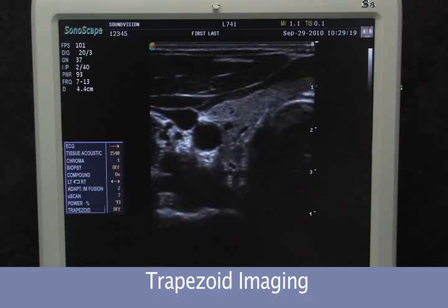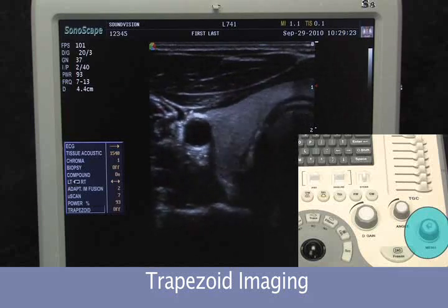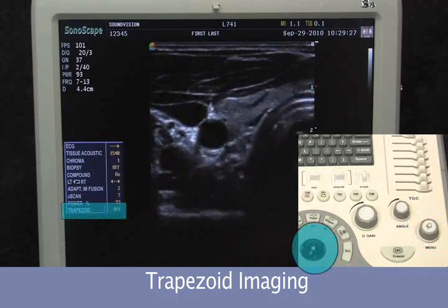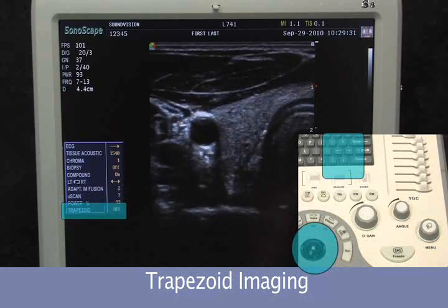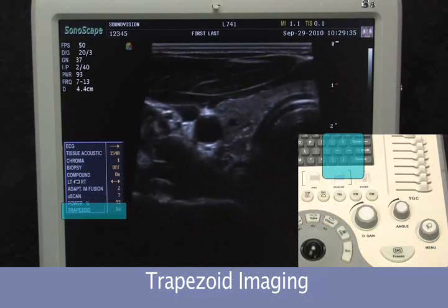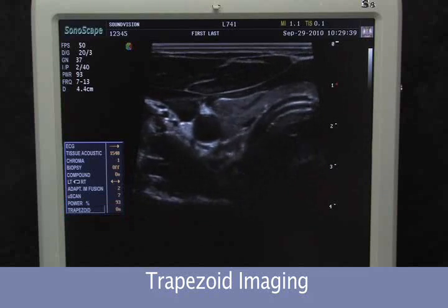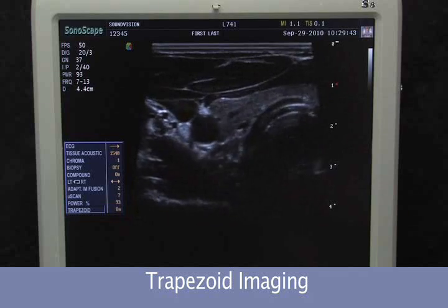When using the linear transducer to achieve an extended field of view or trapezoid, hit the menu button and scroll down with either the trackball or your up and down arrow keys. This display is off — hit the right arrow key, turning it on and giving us an extended field of view. This allows us to have a larger field when using a narrow probe, especially when imaging deep.